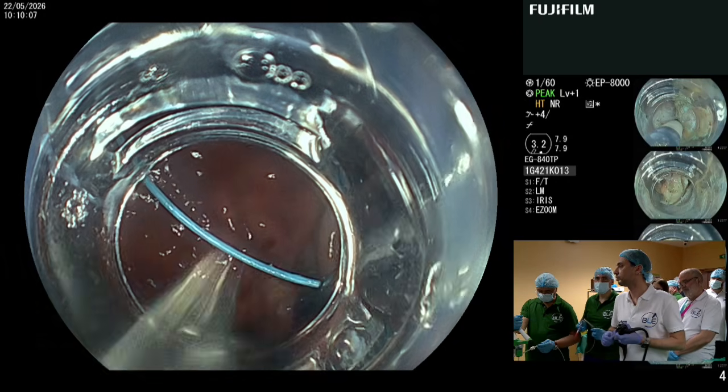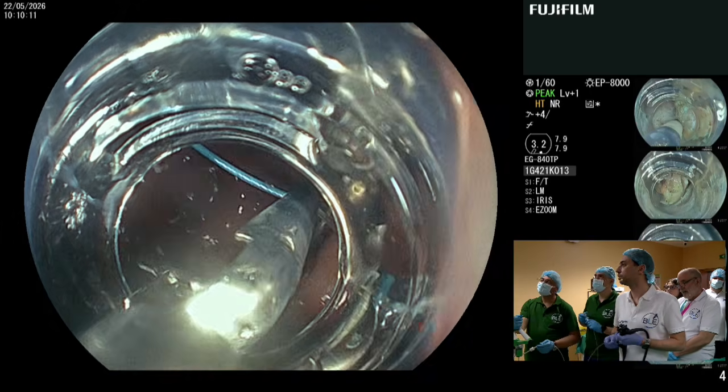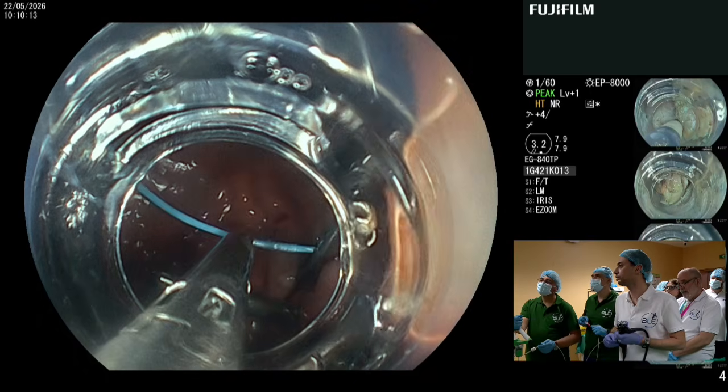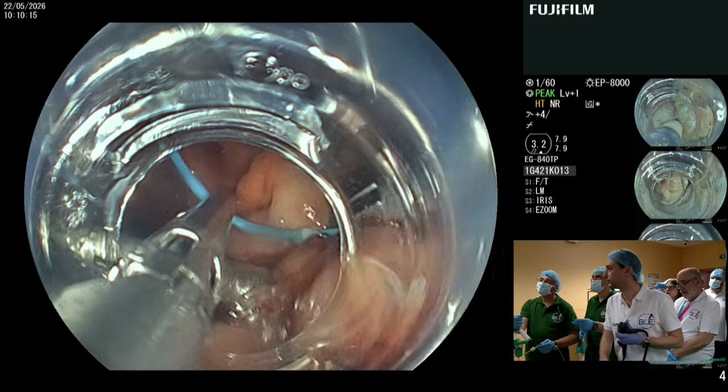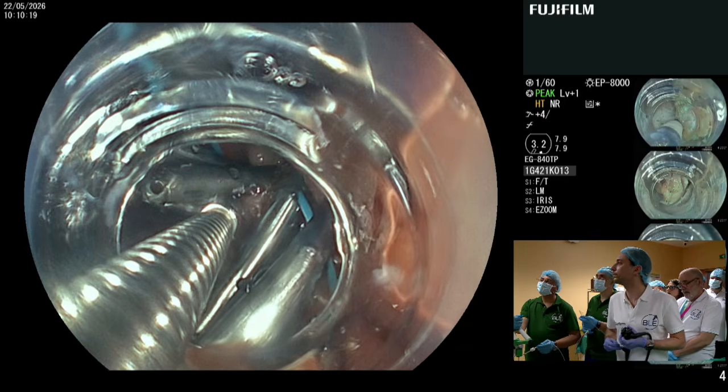Another 2, 3. More. Open. All right. Okay. Close. All right. Open. Close. Fire. Next.